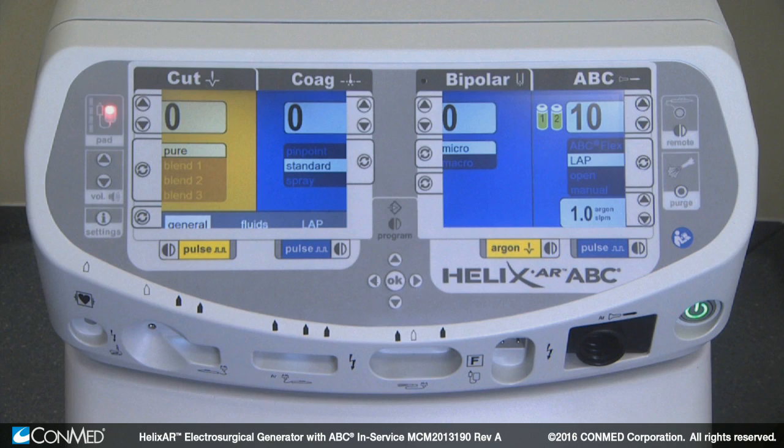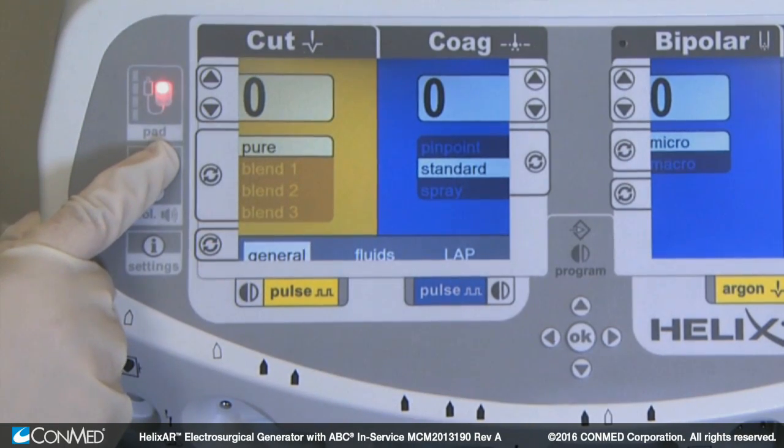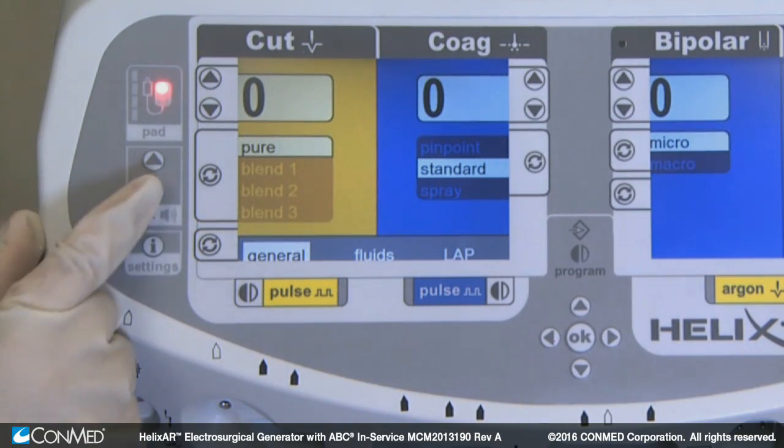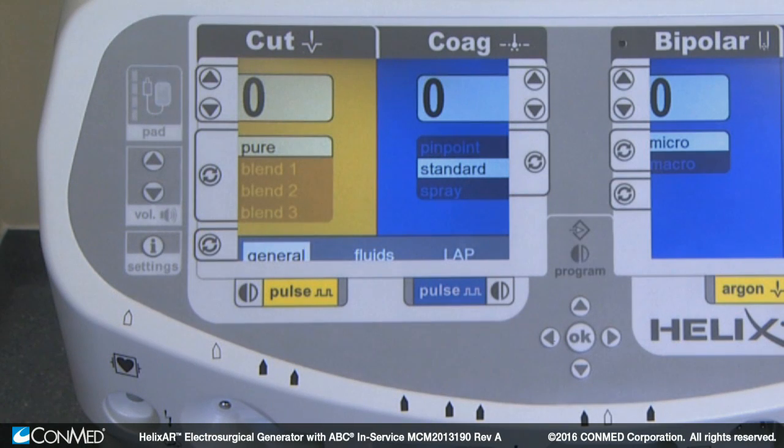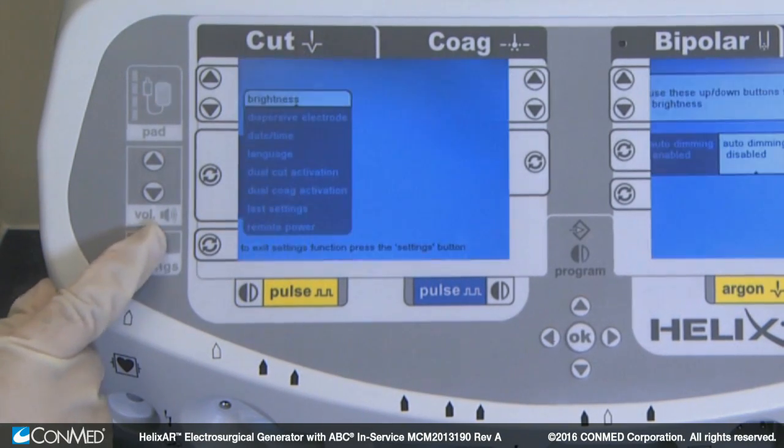Now let's move down to volume control. Push the up arrow to increase volume and the down arrow to decrease volume. Note that certain alerts cannot be silenced. The settings button allows you to change the default settings, which will be reviewed in Module 3.